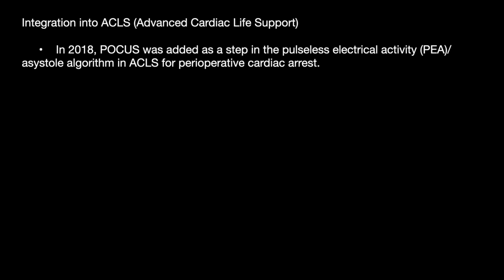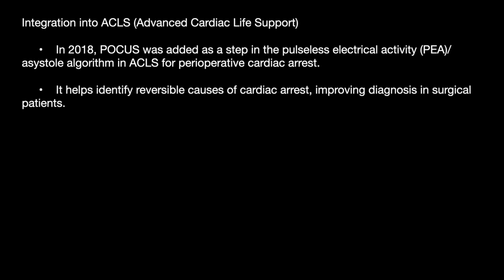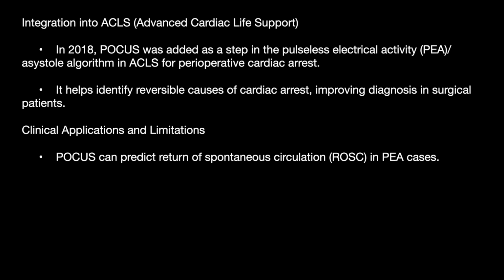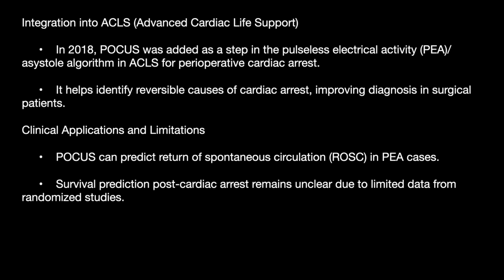In 2018, POCUS was added as a step in the pulseless electrical activity or asystole algorithm in the ACLS for perioperative cardiac arrest. It helps identify reversible causes of cardiac arrest, improving diagnosis in surgical patients. So the application is that it can predict ROSC in PEA cases. Survival prediction post-cardiac arrest remains unclear due to limited data from randomized trials.